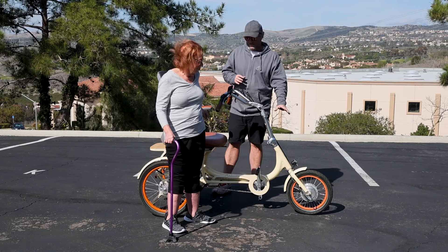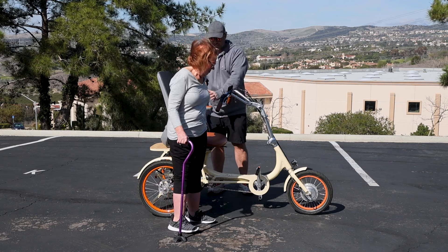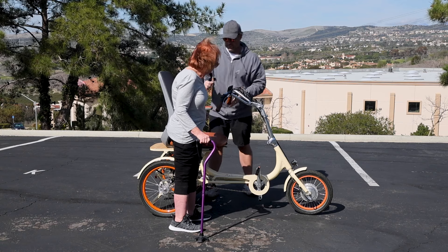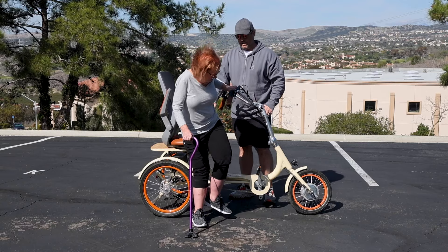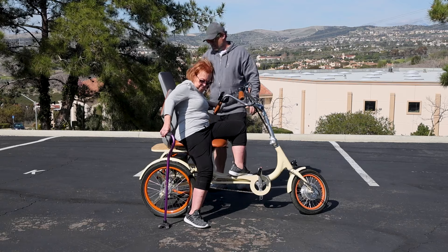This is a 750-watt model. We've got an upright seat here. My mom just informed me we need to get the seat to come a little bit forward, which we're going to work on in the production model. We're going to show you how she can get seated — you can lift the armrest, and with the parking brake on, she can slide onto the seat.